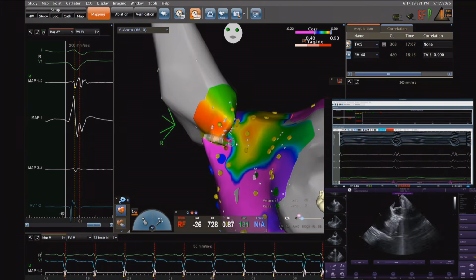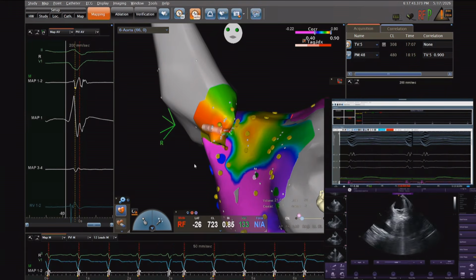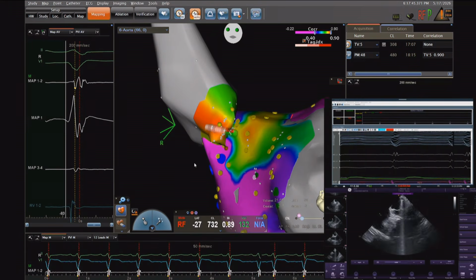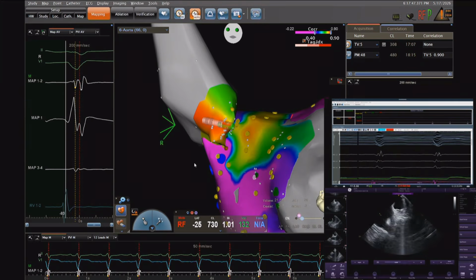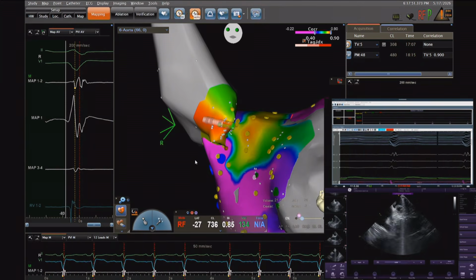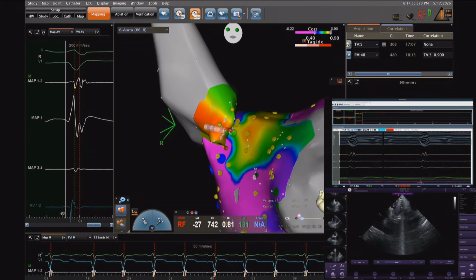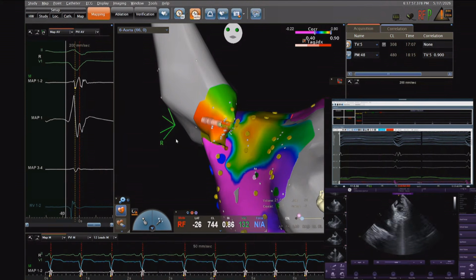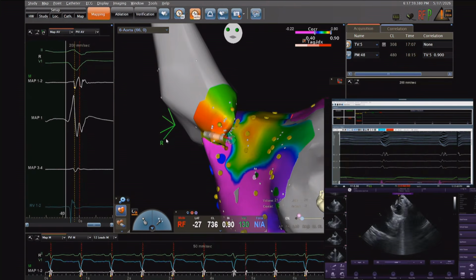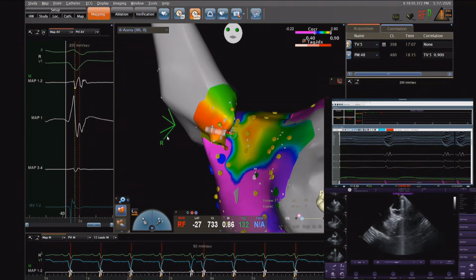But for this particular arrhythmia, it's probably this clinical arrhythmia, which is very fast. And I do not expect very fast arrhythmia from this apical aneurysm. So I think it's quite a complex case. But I believe that we showed most of this pace mapping principle. And we mapped all chambers, even this anterior vein, at least the proximal part of the anterior vein.